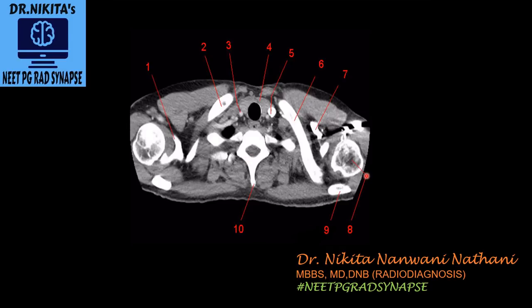Today we're learning about normal anatomy in CT thorax and how to identify structures. First, bones are white on CT — always look at the bone cortex. Next, identify whether it's a contrast or non-contrast CT by looking at the vessels: white vessels indicate contrast; gray vessels indicate non-contrast. Soft tissues and muscles are gray, black areas are air or fat (air is more black, fat is less black), and white on CT is bones, acute hemorrhage, or calcification.